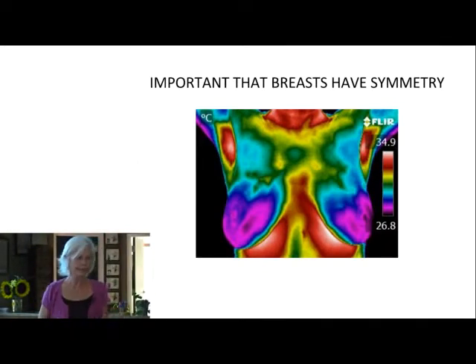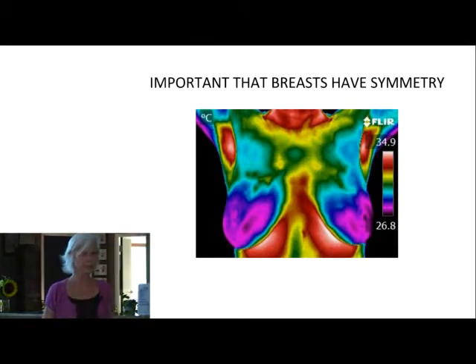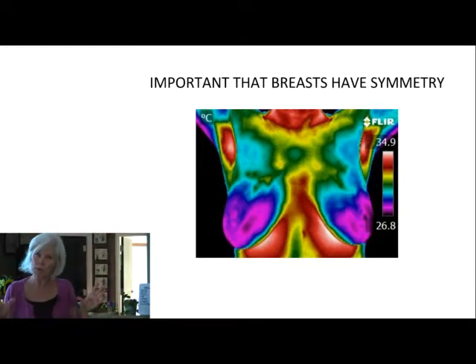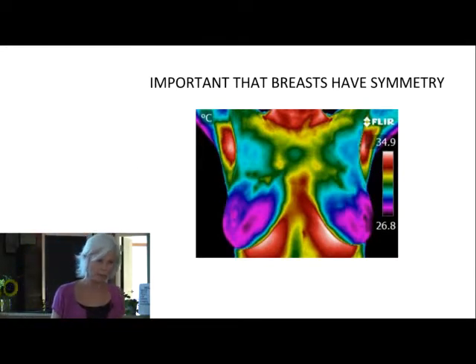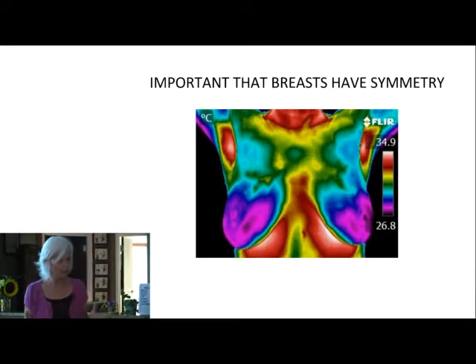This is very detailed work if you do this correctly because we're picking up significant heat, but we're also picking up insignificant heat. So you'll find out when you do this imaging if you have any areas within the breast or even the slightest bit warmer, because my camera picks up heat to less than a tenth of a degree. It's very sensitive. If you ask me, and you can interrupt me at any time, I don't have a script on this. I know my stuff. But you can ask me a question, and a lot of people say, "Well, why haven't we heard about it before now?"